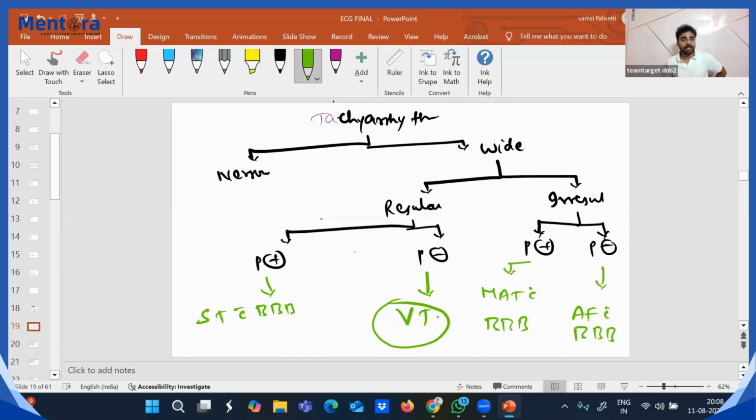Clear this flowchart? Any doubts in this flowchart? It's very easy to deal with this flowchart if you know this. Just after this class also, put this flowchart down and apply your mind to why it is this way. It's very easy.